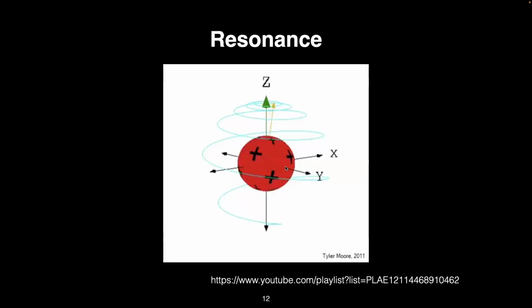So here it's shown vertically for convenience for showing the rotation. In practical purposes, this is horizontal because the tube of our magnet is horizontal. So then the field lines that represent that main strong magnetic field run horizontally. And then X and Y is that plane perpendicular to that main field. Is that reasonable? Any questions or concerns?